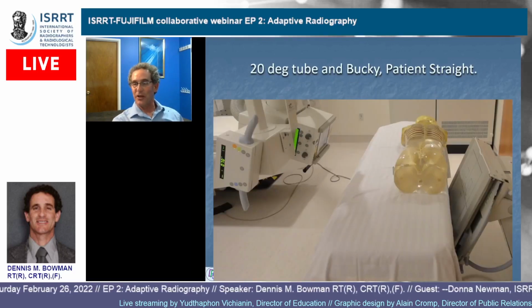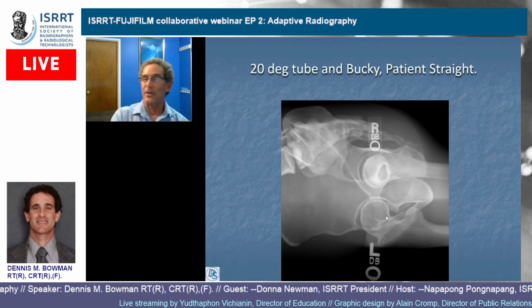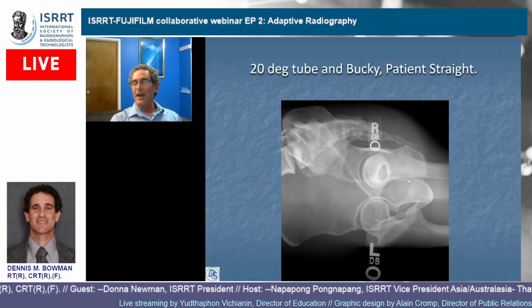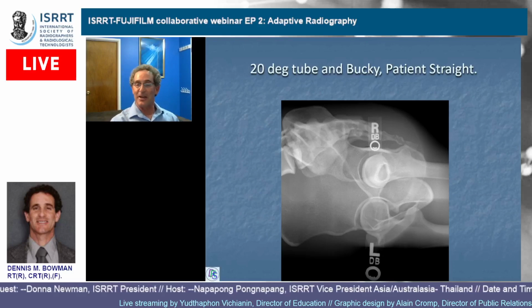And then this is what it looks like. So then we shot, that's a real patient. This is our phantom. And now we're going to shoot that phantom. And it looks just like that. And you go, well, that's pretty cool. Like that would work right there without any other angles. That's still a cool looking shot. You're not seeing up through the neck like you normally would if you were coming up at that angle. But still, that's pretty cool without anything.